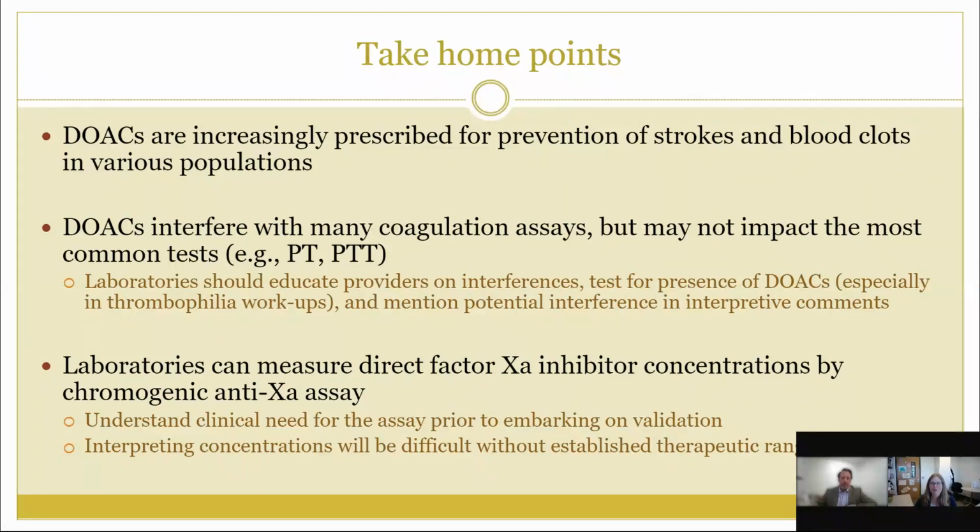Yeah, it's hard because not all of our patients who come to the emergency department on apixaban or rivaroxaban necessarily get an assay sent to the lab, so it's hard for us to know exactly how many. But these oral anticoagulants are extremely common, and I think it happens more often than what we see testing for, is what I'm trying to say.